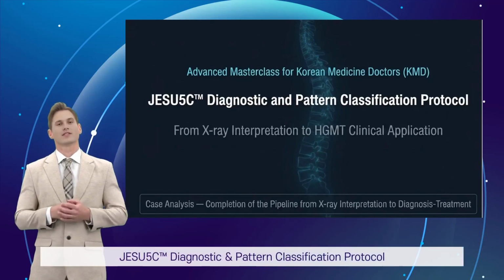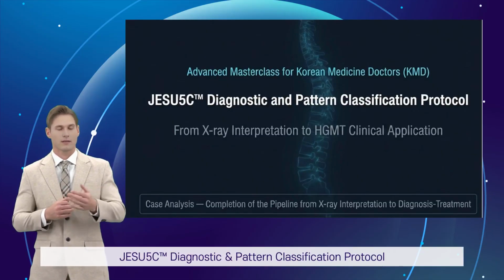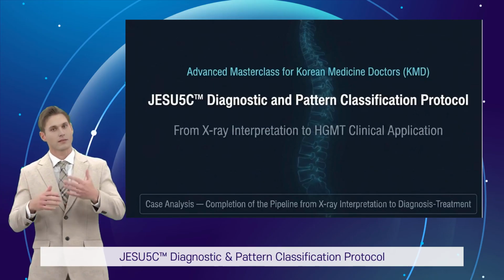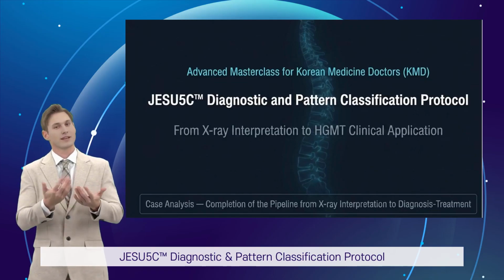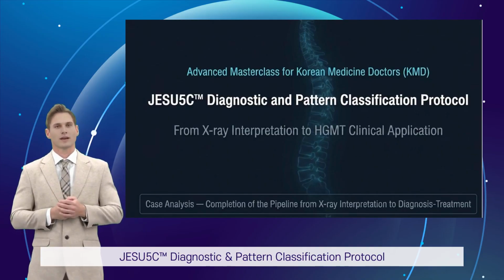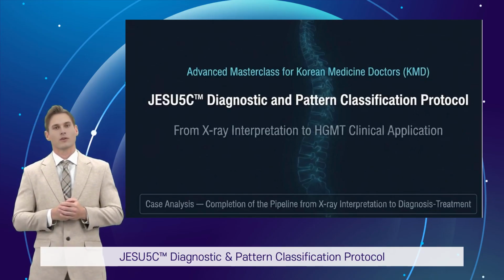Welcome to this advanced masterclass on the JESU5C Diagnostic and Pattern Classification Protocol. Today, we'll walk through exactly how to establish the Hyun-Ga Axis through X-ray reading and how that translates into a precise clinical application of HGMT. This session is designed specifically for practicing Korean medicine doctors who want to apply this protocol directly in clinical practice. Let's get started with a real case.